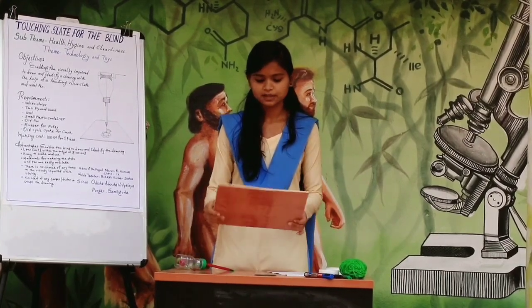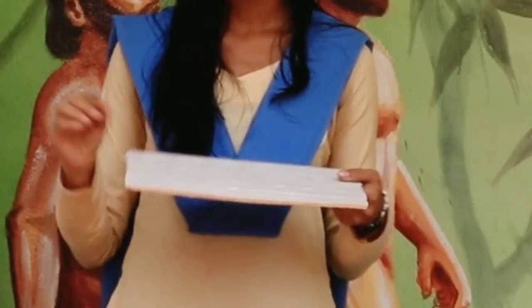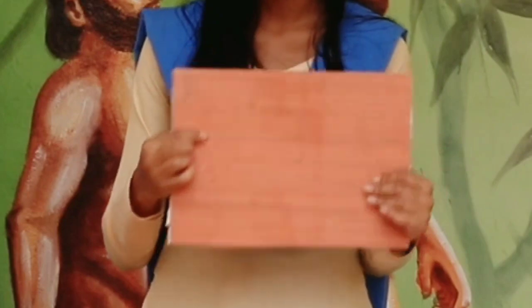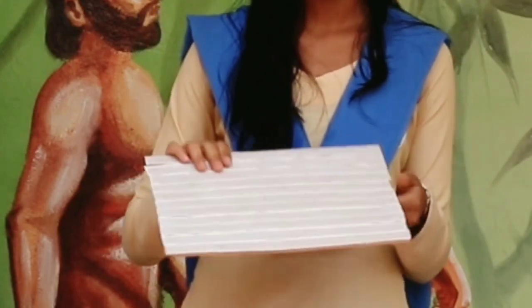First we will see how to make the slate. The slate is made by pasting the male Velcro strip over a thin sheet of foam board. This is how we finish making the slate. Now we will see how to make the pen.